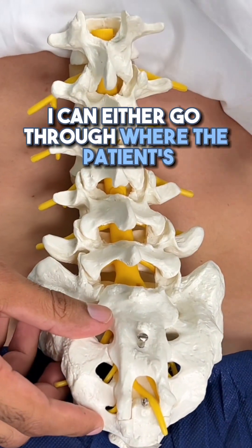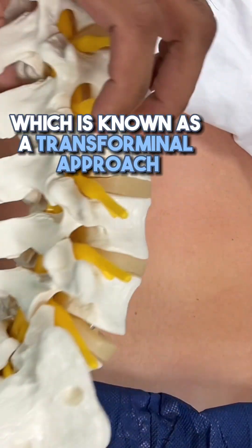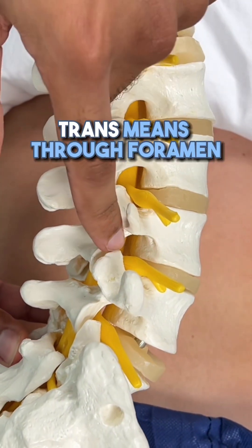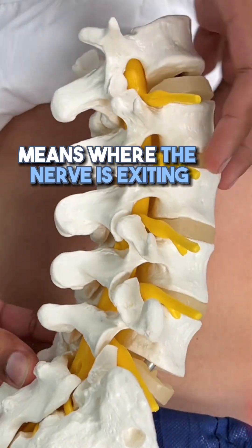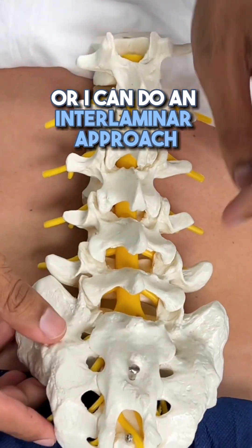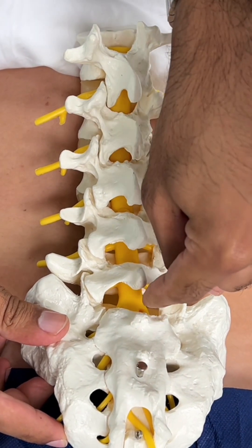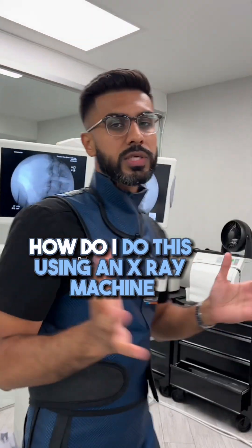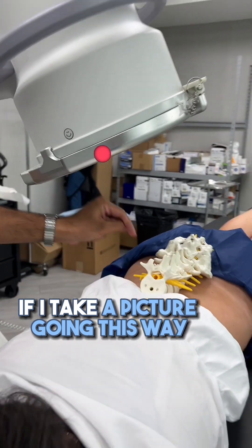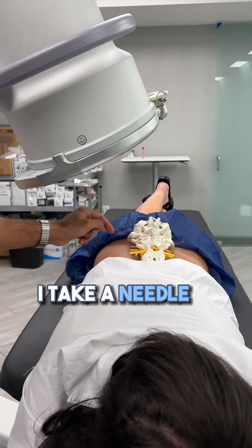I can either go through where the patient's nerves are exiting, which is known as a transforaminal approach. Trans means through, foramen means where the nerve is exiting. Or I can do an interlaminar approach, which is where I go through the lamina right down the middle. How do I do this using an x-ray machine? If I take a picture going this way, it gives me access through the foramen.